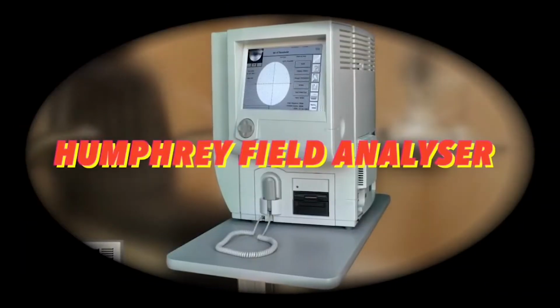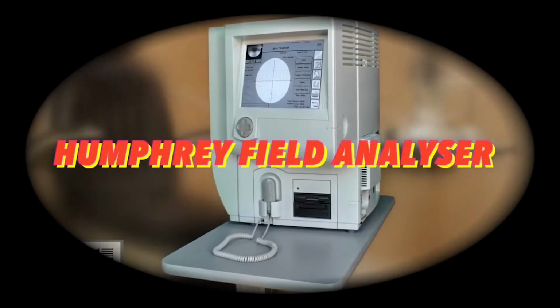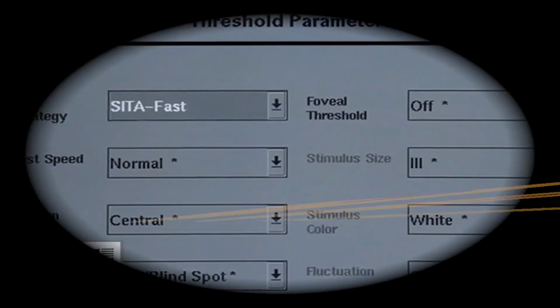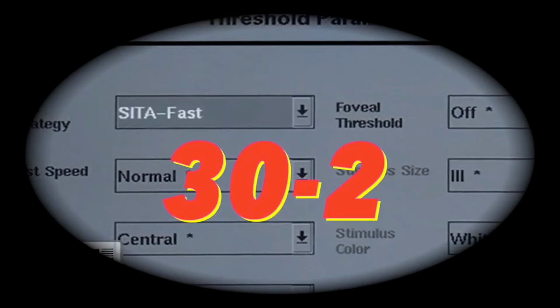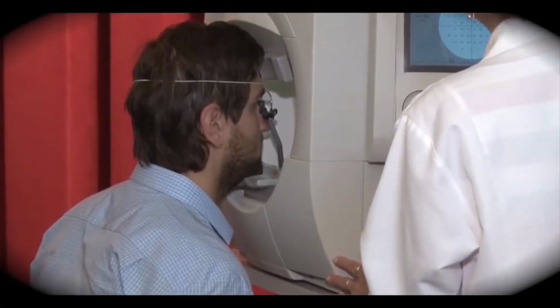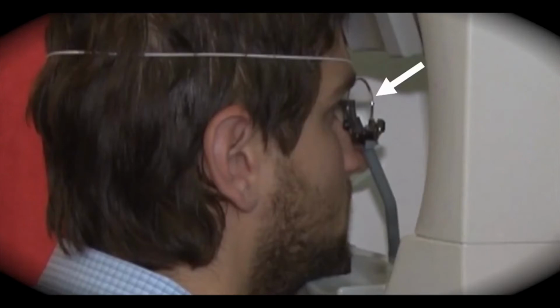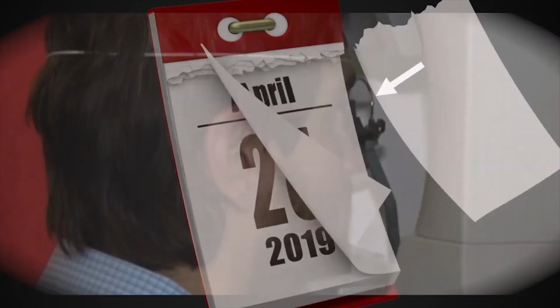The Humphrey Field Analyzer was used, and out of the various diagnostic protocols, we chose the 30-2 SITA FAST. After written informed consent and ethics approval, each patient was explained the procedure and how to perform the test. We collected data over a span of 3 years from March 2018 to March 2020.